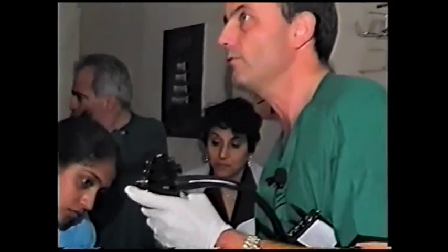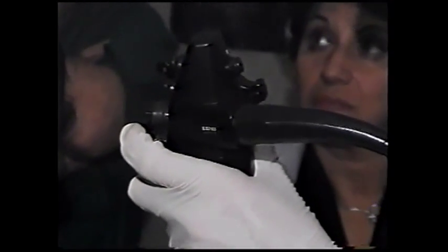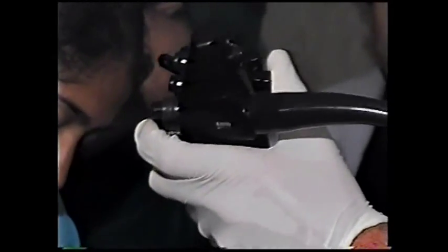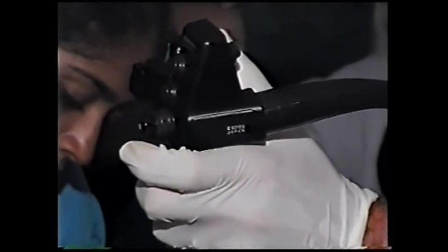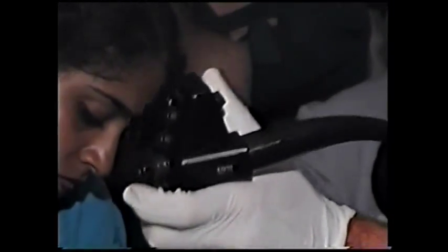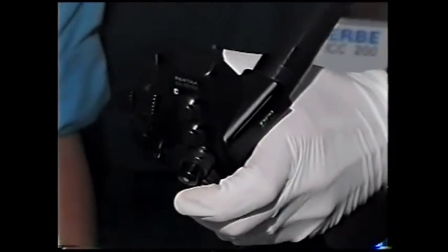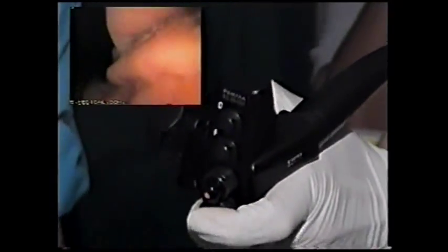Sedated, and for this purpose I'm using a standard video scope from Pentax. It's a diagnostic scope. The patient is in the left side position, and our colleagues here from this institution performed histoacrylate cyanoacrylate treatment of fundal varices, I think a few weeks ago, and therefore first I will check how successful they have been.